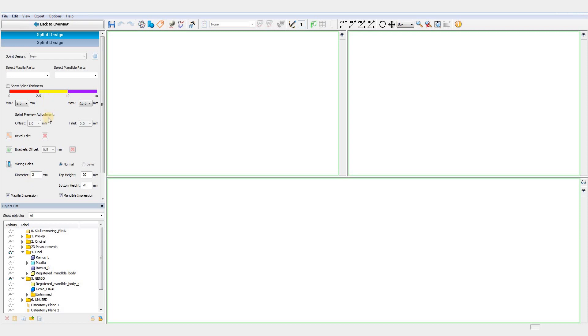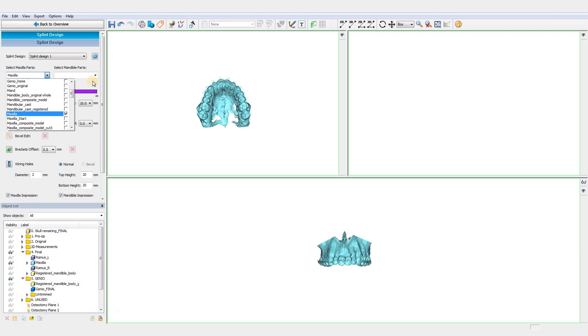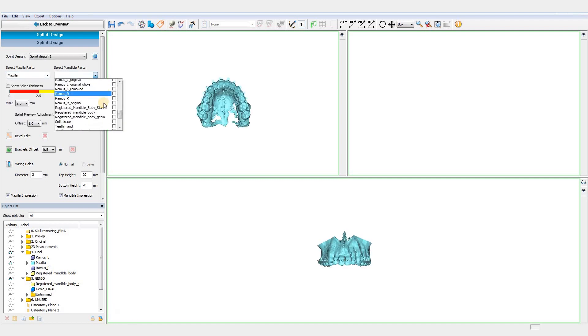Once you have performed your orthognathic planning, as also shown in a dedicated video to this topic on our website, you'll have all the required input to design your splints.